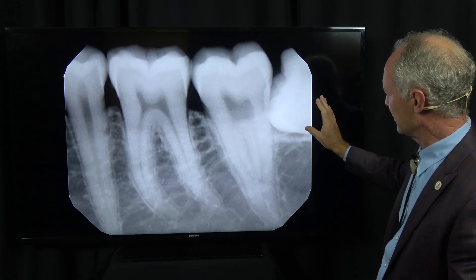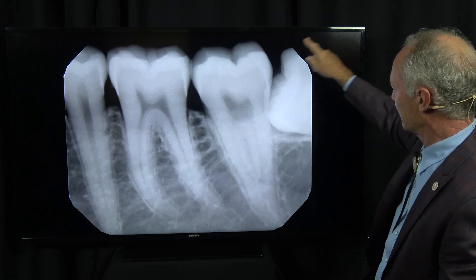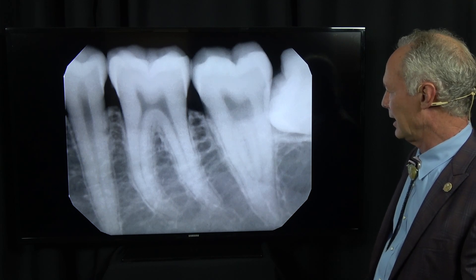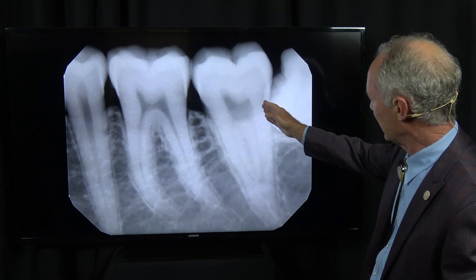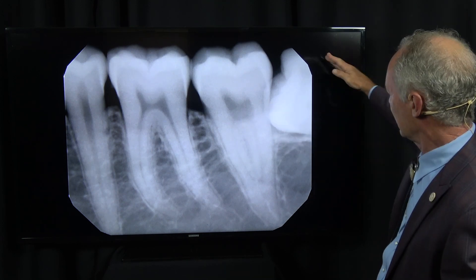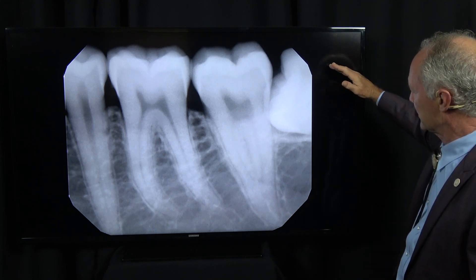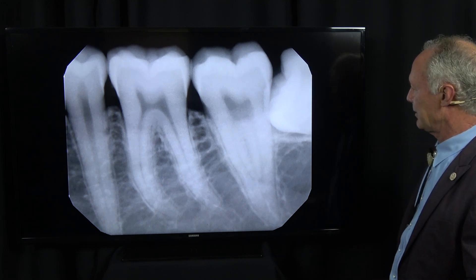If it's not a complete horizontal impaction, you're going to section this part and take out the front part and then the back part. You've always got to have a space to move a tooth into. If you tried to remove this tooth and it's wedged against the second molar and also has bone on the coronal side, it doesn't have a space to move into — so you have to create a space.